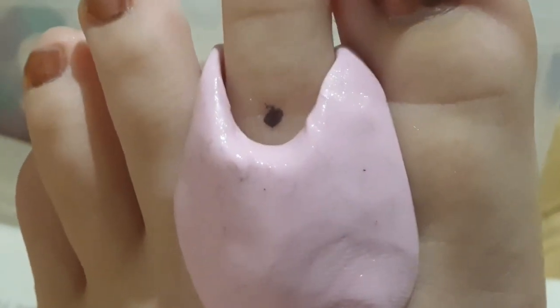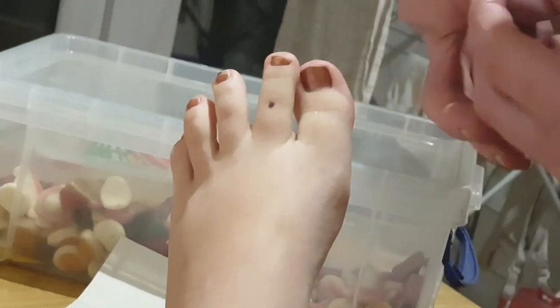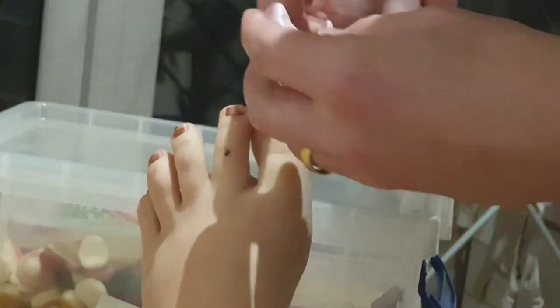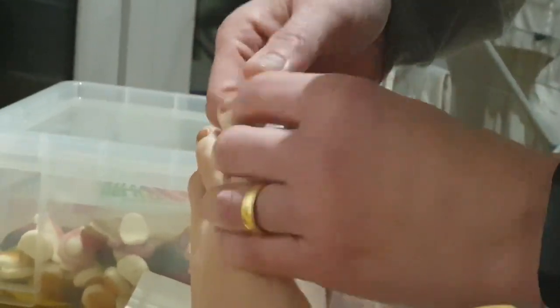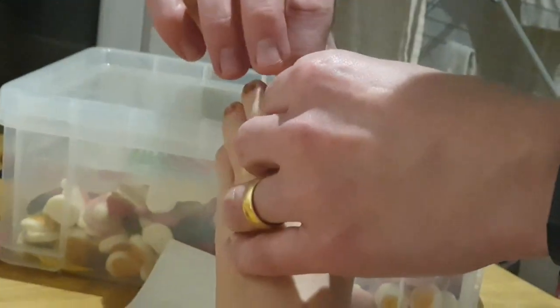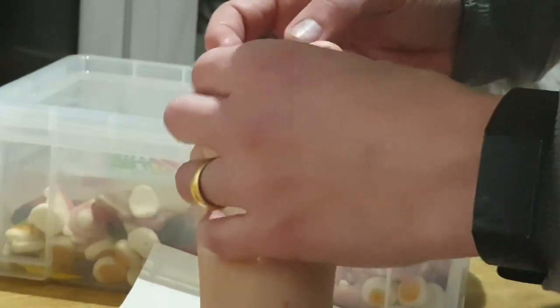So that would be your first one if you wanted to deflect off of it. The second one would be a similar sort of corn in the same sort of place, but if you actually want to cover it over. Once again you sort of half mold it around your finger. Pop it on, but this time you actually leave a cover over the corn. You don't necessarily want it to be very thick over the corn, but this is really good if you get those ones that are really really dry — you squeeze it so it's as thin as it can be over that knuckle.